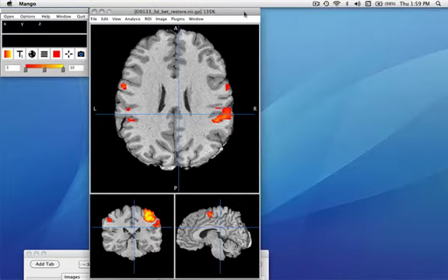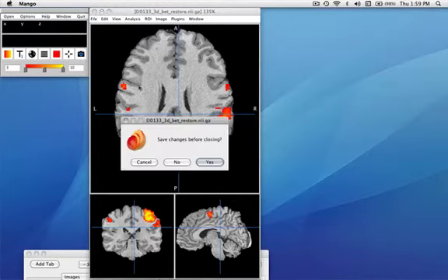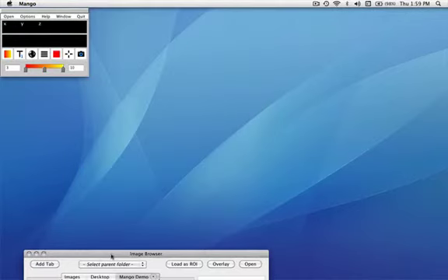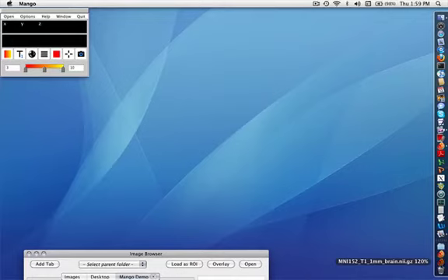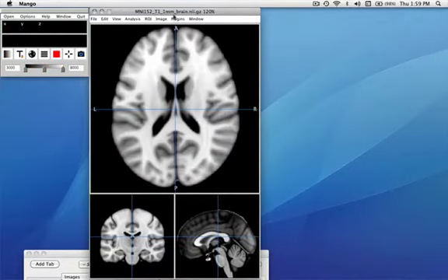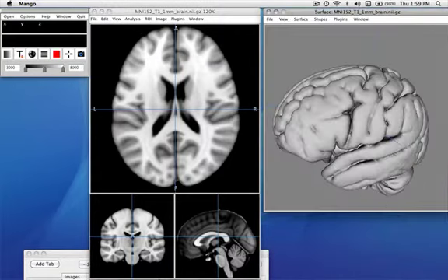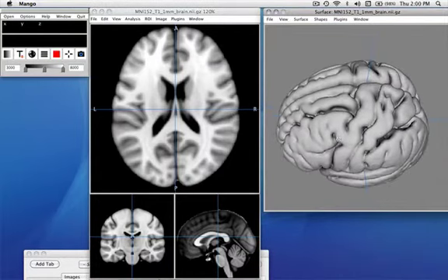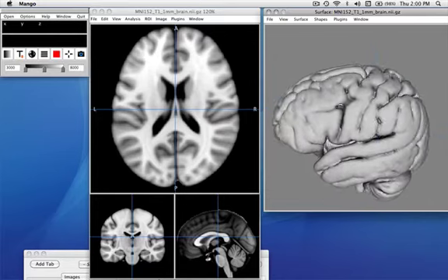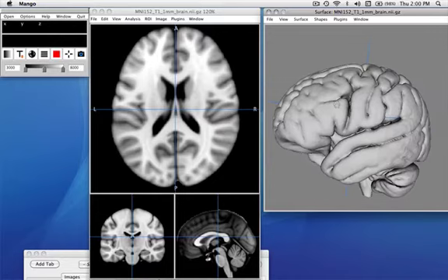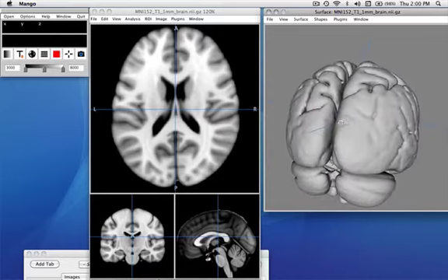I'd like to show one other interesting feature. We don't have to have things in Talairach space to do the overlays. Let me open this image — this is the MNI 152 T1 1mm brain that we got from the FSL site. The highest value in the image is around 8,000, so that's a nice contrasty image. We also built a surface — not quite as much detail, but this is an average image from 152 people. We threshold it at about 60% of the max and still have a nice surface to look at.